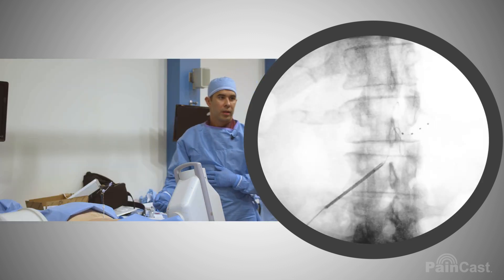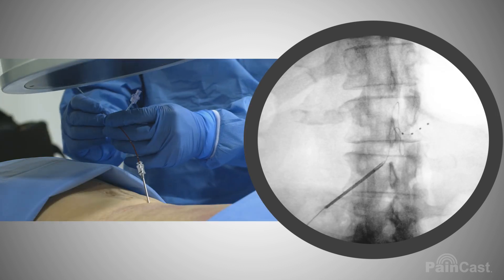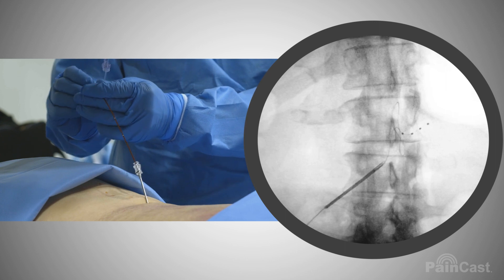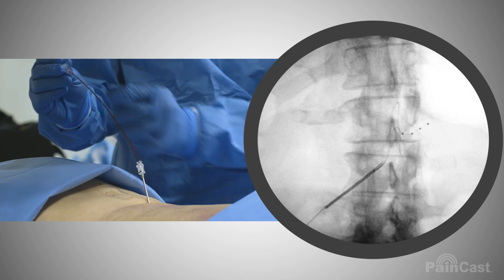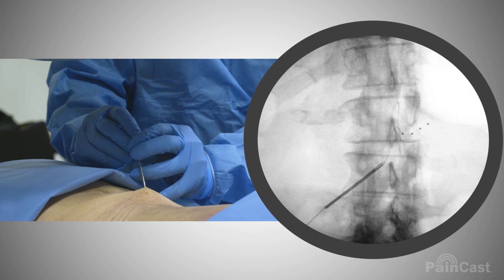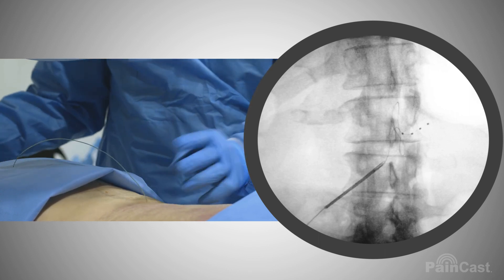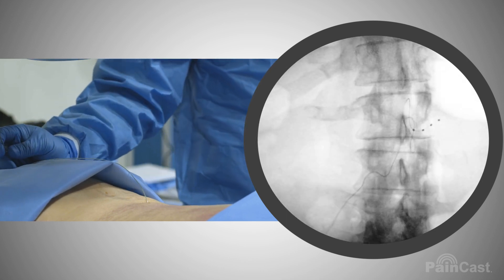We'll go back up AP, and at that point we would take the stylet out a little more, advance, and take it out. Beautiful. Good job.